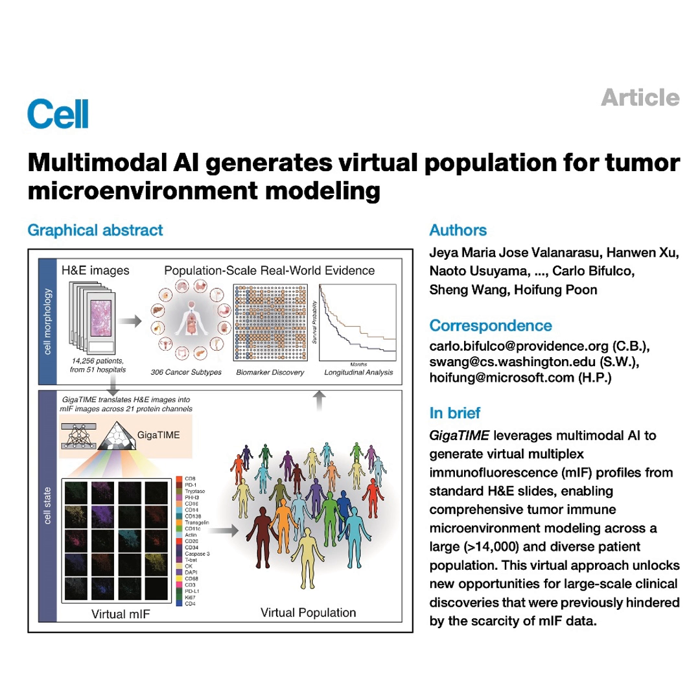And then the second part. The decoder. It takes those abstract features and expands them back out, but this time into 21 separate high-resolution images, one for each protein channel. So it's literally translating the visual language. It sees a certain cell shape in the H&E and basically says, okay, based on my training, that shape and its neighbors means there's a high chance of PD-L1 activation right here. Exactly that. For every single pixel, it's performing a binary classification. Is this pixel on or off for this specific protein?